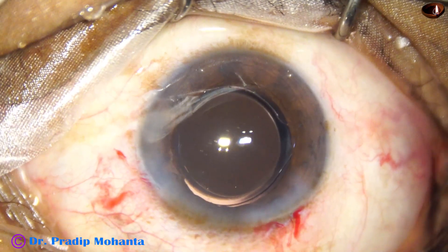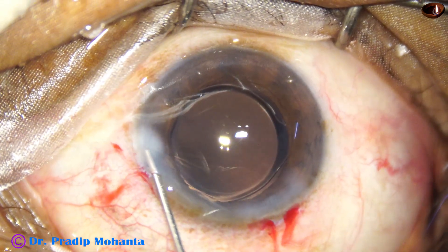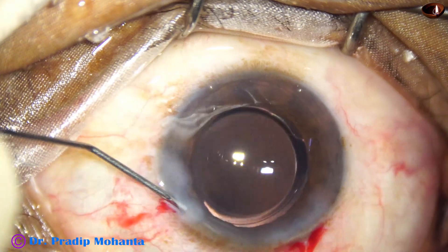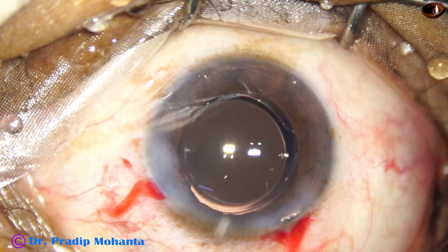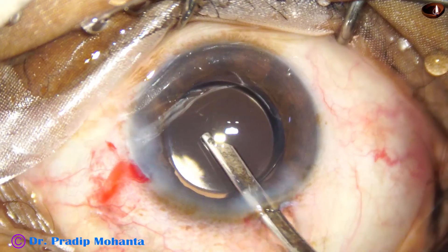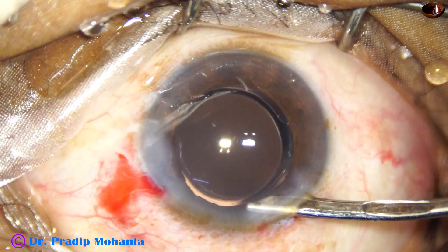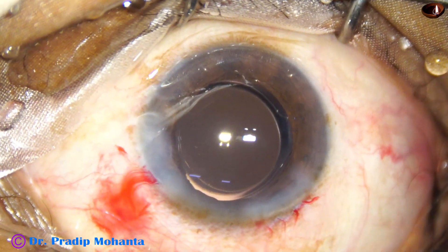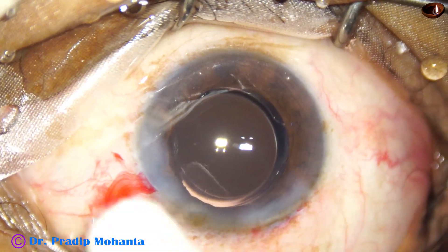A little bit of moxifloxacin is applied. This is the final lavage of the anterior chamber — the anterior chamber is nicely formed, integrity of all the wounds is checked. A few drops of moxifloxacin are applied over the ocular surface and the case is concluded.